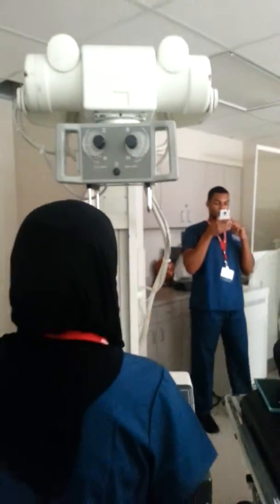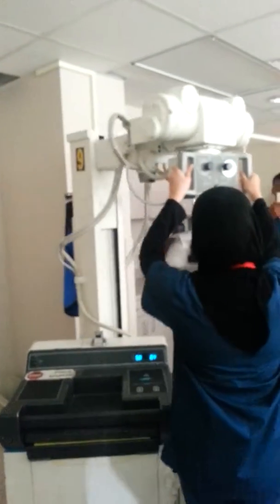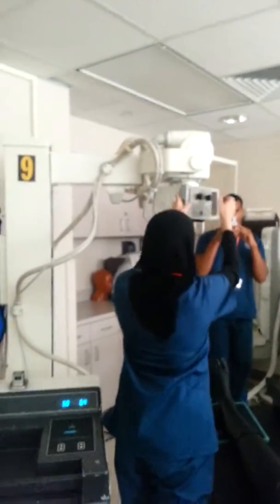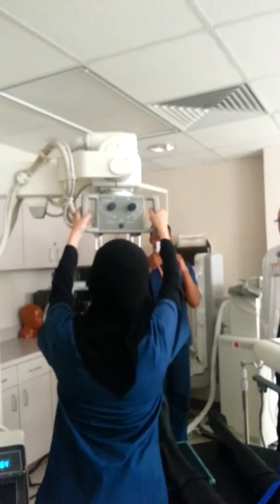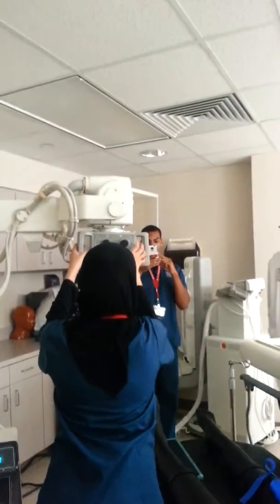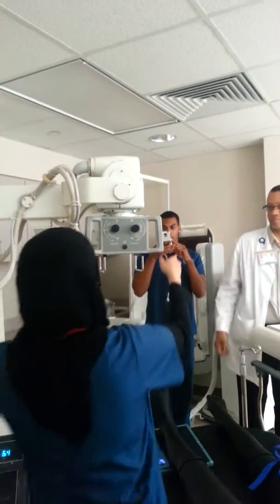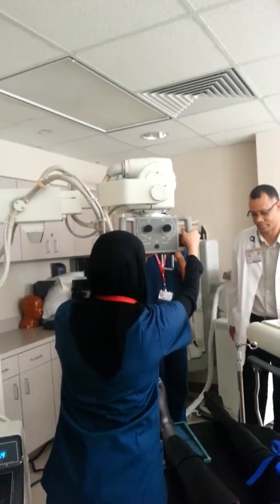She's moving the portable forward. Rotating the collimator. It doesn't matter which direction the collimator is facing. You can bring it. Remember to extend it out.